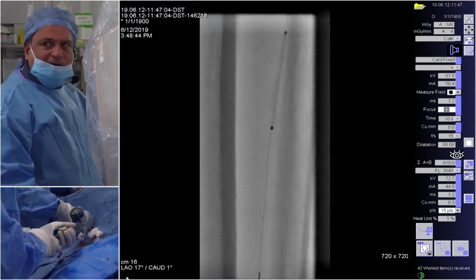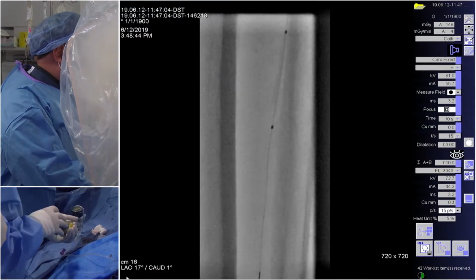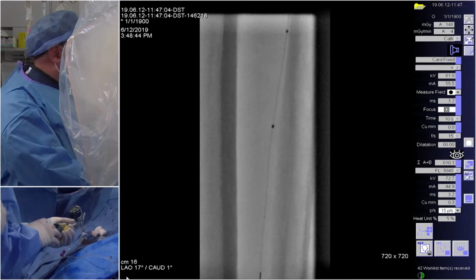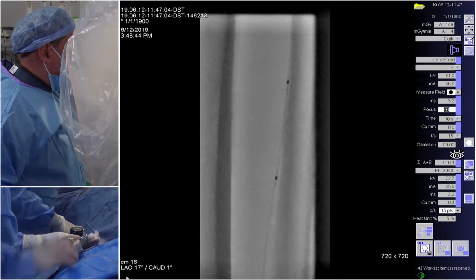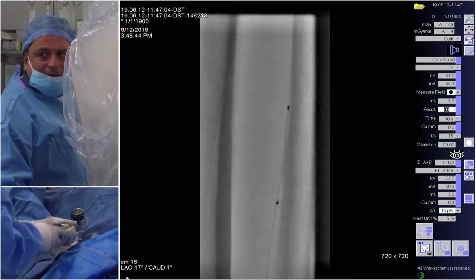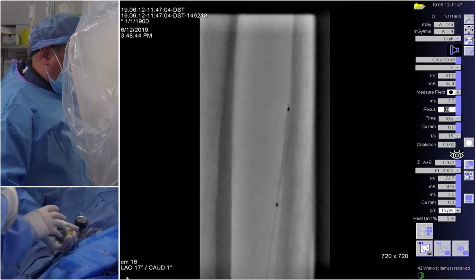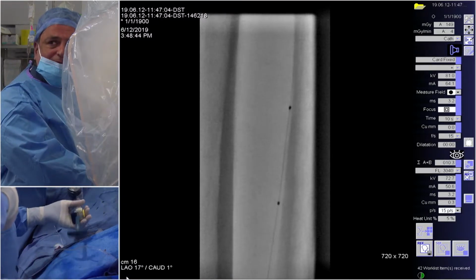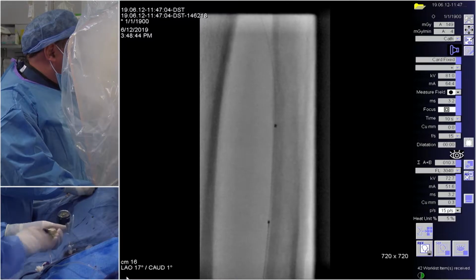Prakash, what balloon is that? This is a 2.0 by 30 coronary balloon, guys? Yeah, an NC. It's an NC Abbott, I think. Emergent. We're just ballooning this with a monorail balloon, Rob. We also have a 0.9, right? No, 1.6 we have, right? And we have a 1 millimeter balloon from Boston. 1.5, 1.25, and a 1.